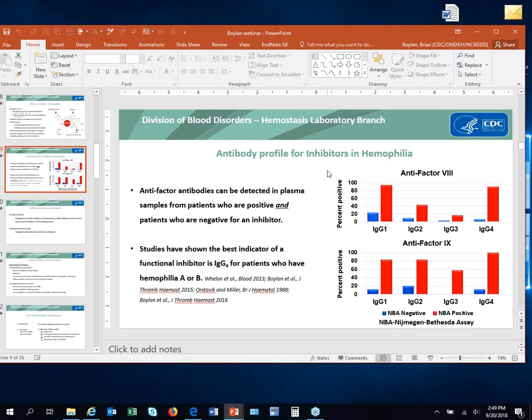Unfortunately, I've had a hard time finding other clinical laboratories that have the means to test samples using the chromogenic version. And I've heard whispers that some of the clinical laboratories are looking into getting their own test approved to do this, but it seems to be a slow go at this point.